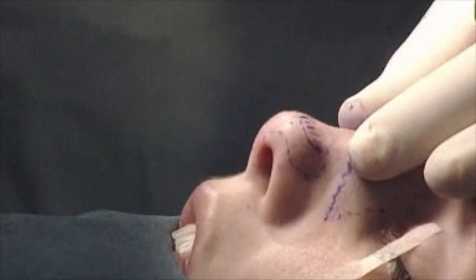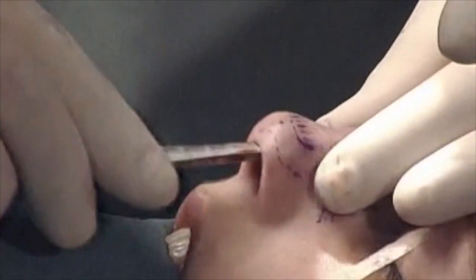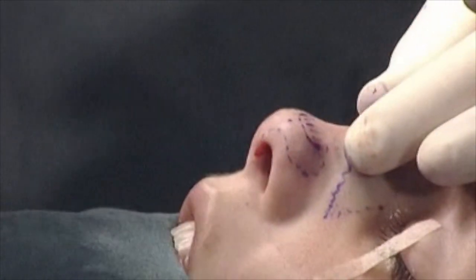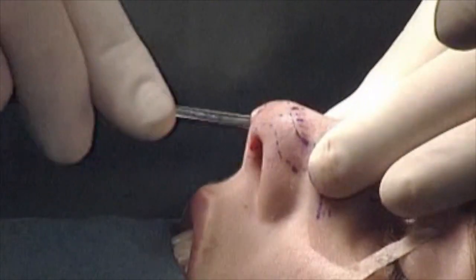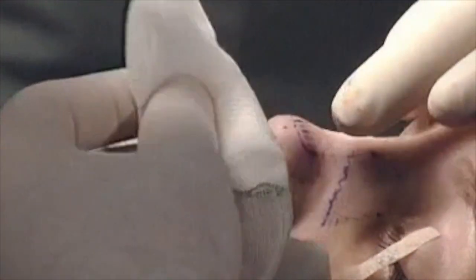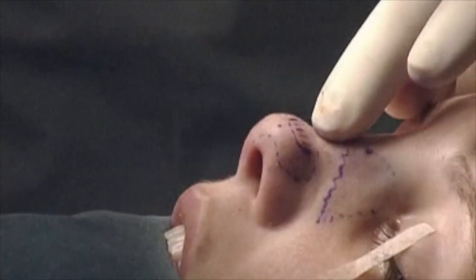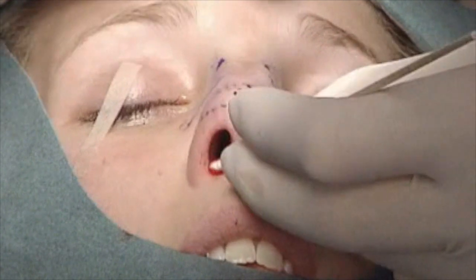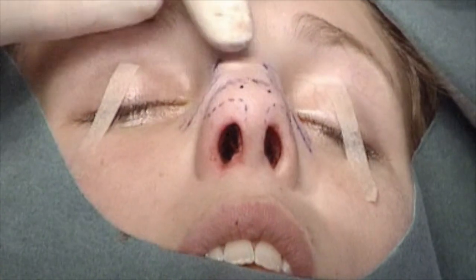The other bony part, the other side. Okay. Feels better.